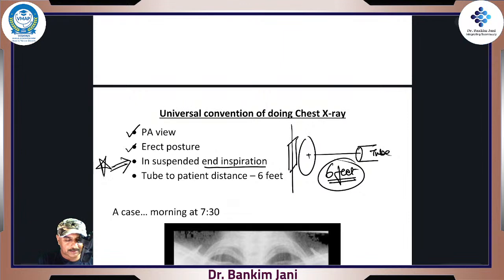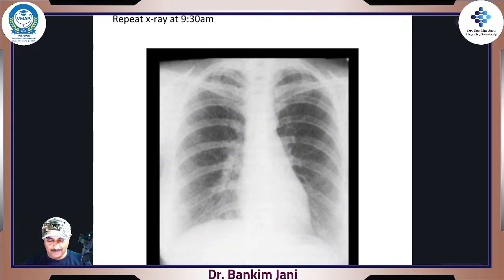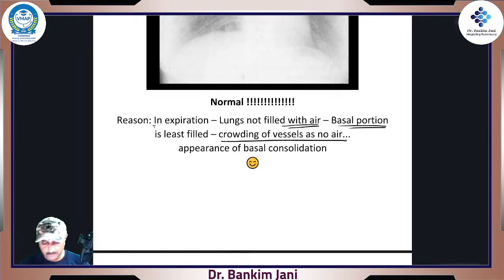That's why this is considered so important, right? Because this can give you so many false results. Now if the lungs are collapsed, unnecessarily the heart occupies more space and it looks like cardiomegaly. The moment it was full deep inspiration, suspended inspiration, see, it is completely fine, completely normal, all good, right? That's why those universal conventions are to be remembered.